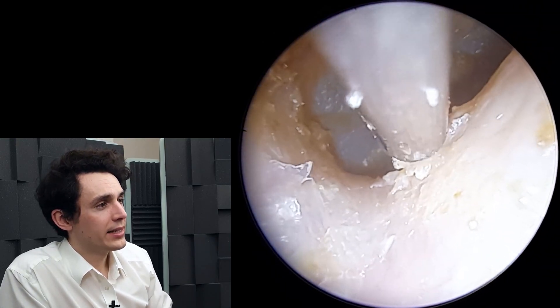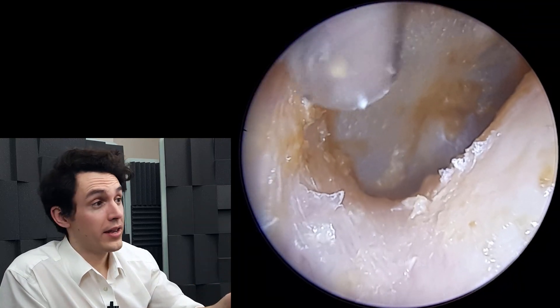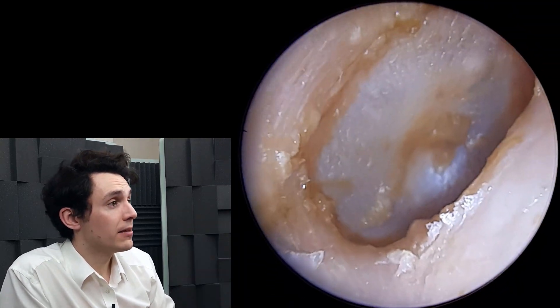Just getting this last little piece of dead skin here. At this point, the patient felt like their hearing was much, much better. So overall, a fairly good outcome. A short video today, but I thought it'd be very interesting just to show you how this is one of the few cases where hydrogen peroxide has actually had a positive outcome — a positive effect on the patient rather than a negative effect.